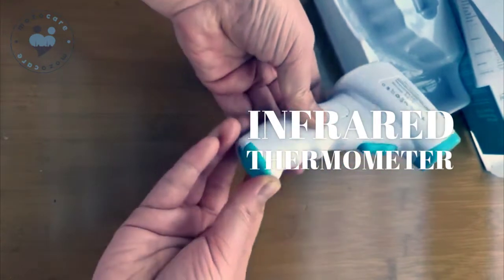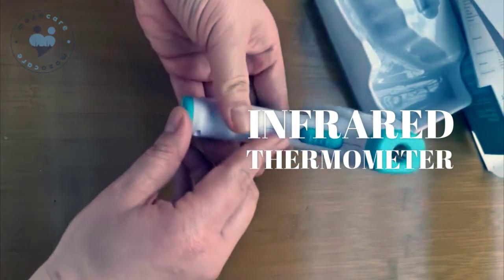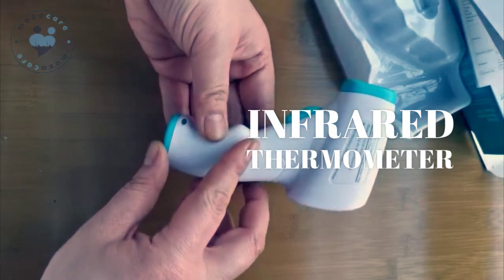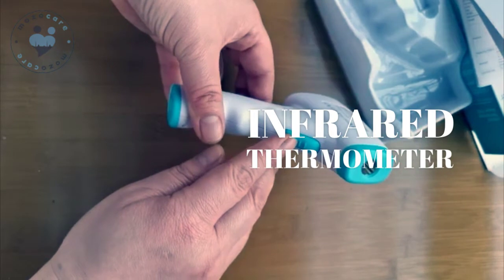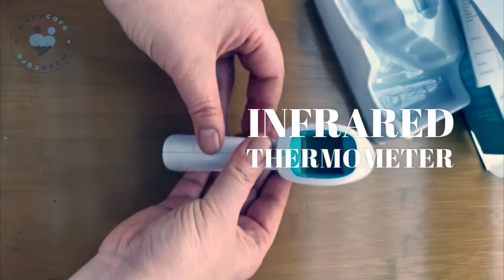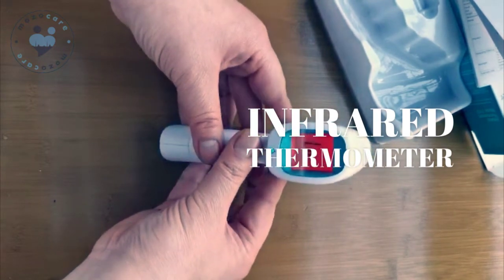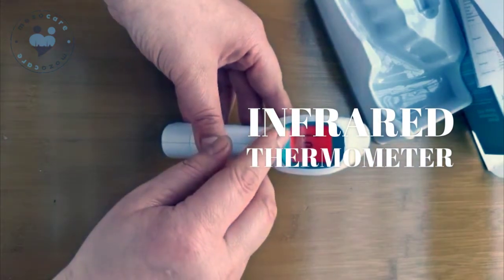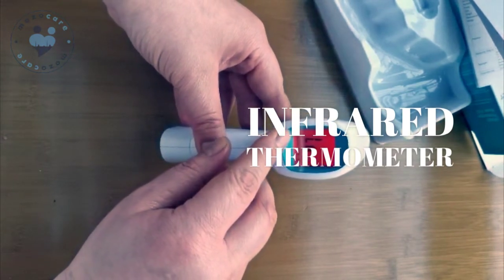Close it. Once you put the battery in, press this button to turn on the machine. You can see here it shows body temperature, so now you can test your body temperature.